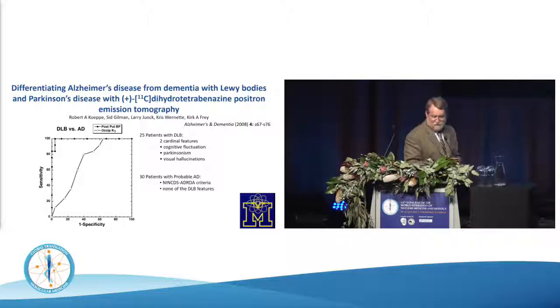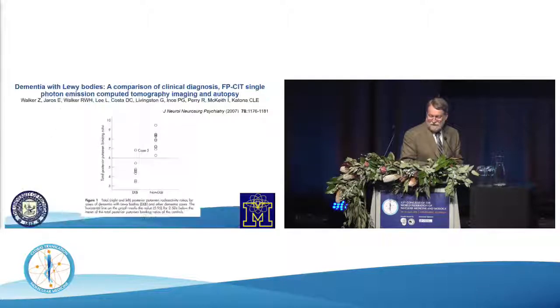And you can see it does far better than chance, but about 30% or so of DLB patients don't manifest significant occipital hypometabolism. Whereas the loss of nigrostriatal presynaptic dopamine terminals is a virtually perfect diagnostic distinction here. And so it turns out that ioflupane SPECT here from the group at Newcastle has a very similar ability to separate dementia with Lewy bodies from other dementias.